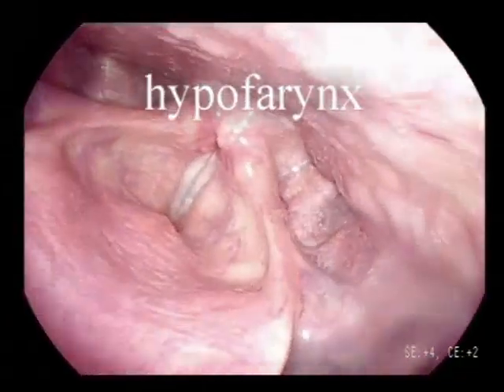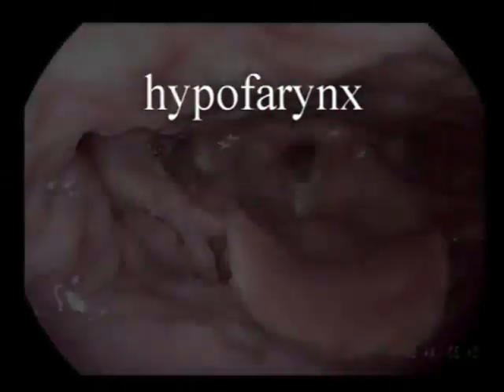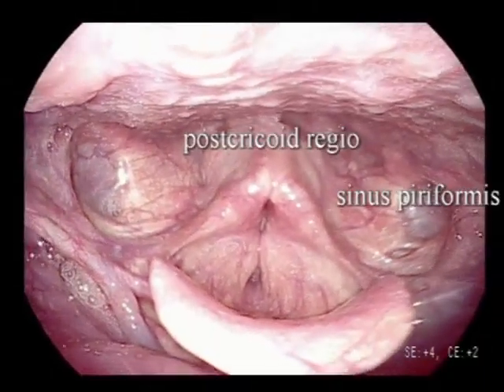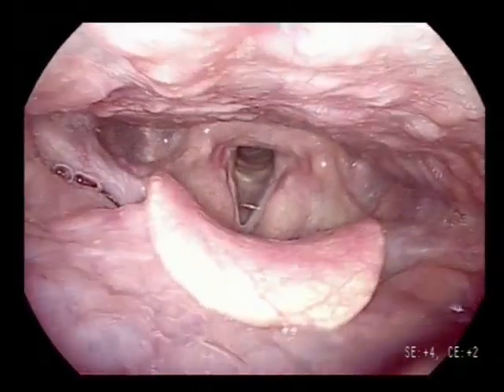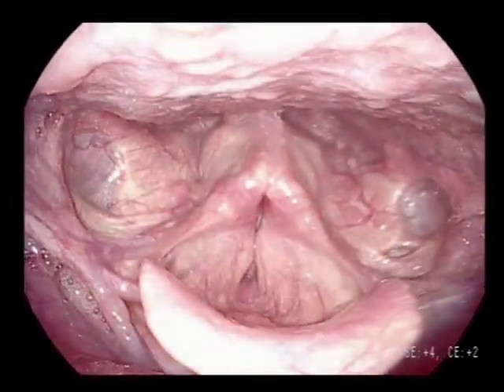To adequately visualize the hypopharynx, the patient should perform a Valsalva maneuver by blowing on the hand, which results in air in the hypopharynx. A Valsalva maneuver combined with pressing the tongue against the palatum results in an even better view.